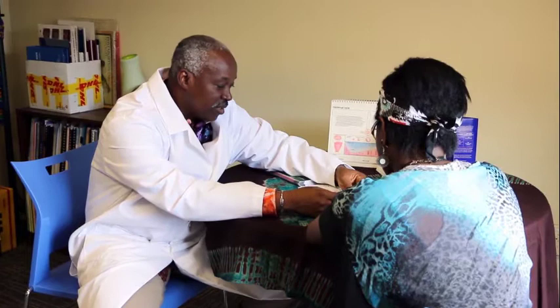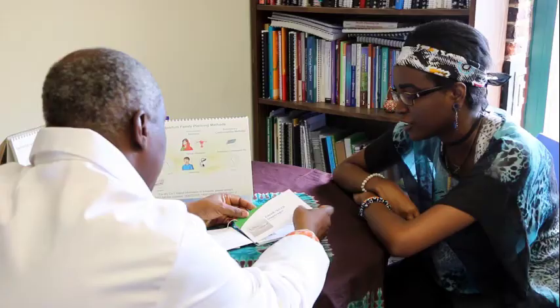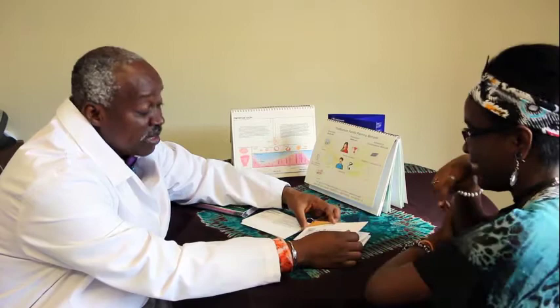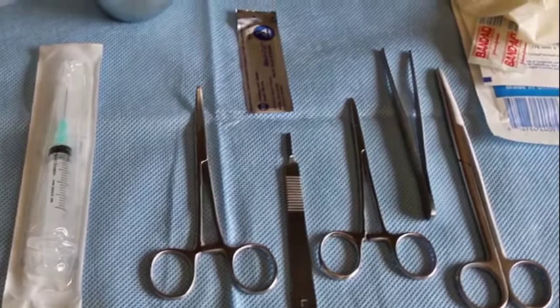When a client comes into the clinic for a removal of an implant, discuss with her that return to fertility is immediate and counsel her on selecting another family planning method if she would like to continue using contraception. Begin by confirming consent from the client for the removal. If she would like another implant placed, make sure that the equipment for insertion is available at the same time the current implant system is removed.